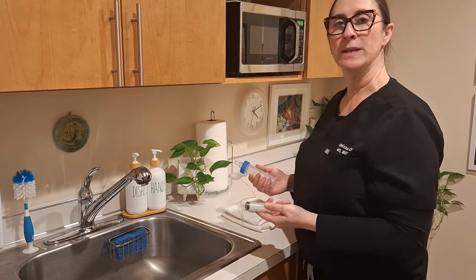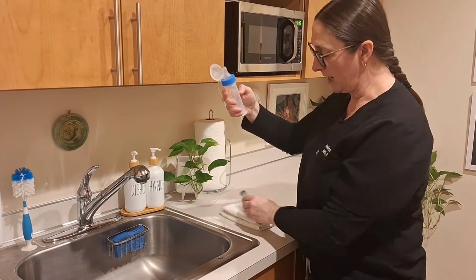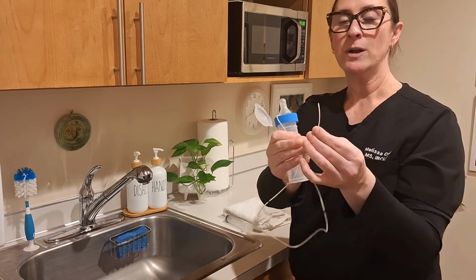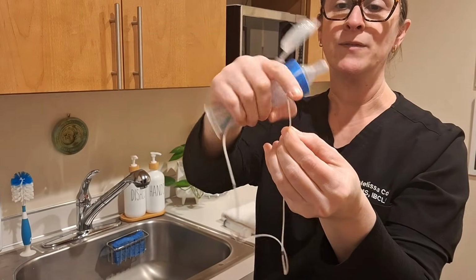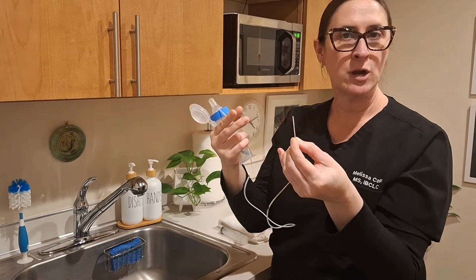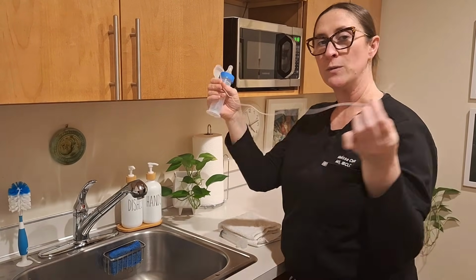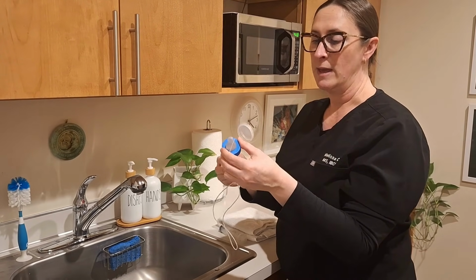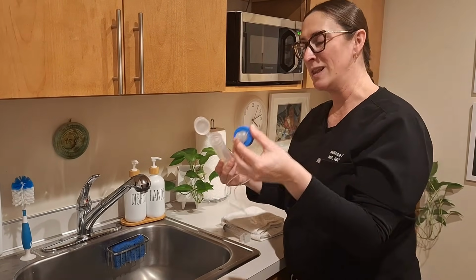When your baby has completed a feeding and you're ready to clean the tube, it is important to flush it each time because it tends to collect residue. I know it's a little bit hard to see, but the tip of the tube is closed and has multiple openings. Do not cut the tip off. It will become sharp and could be unsafe to use, but it does require that we flush it thoroughly. These tubes, particularly the ones that are not polyurethane, can melt or get warped in too much heat. So I wouldn't suggest sterilizing it or boiling it.